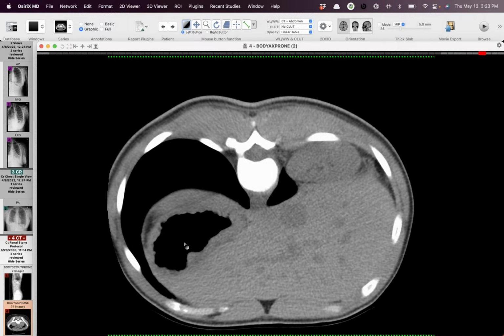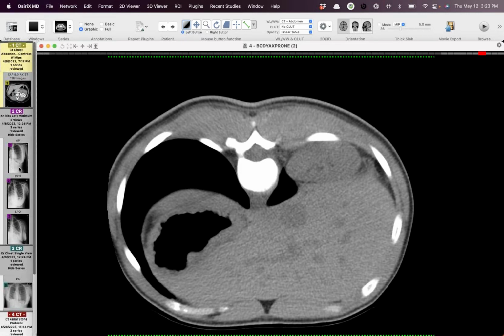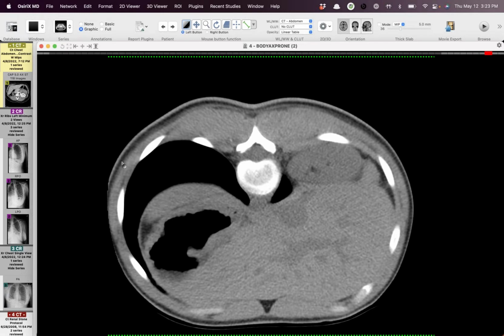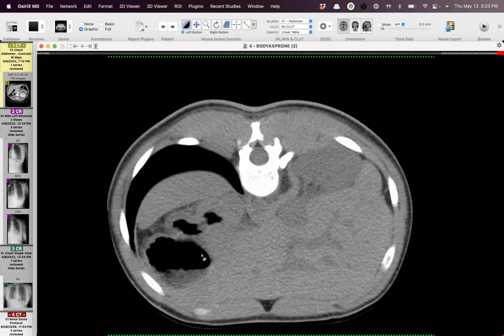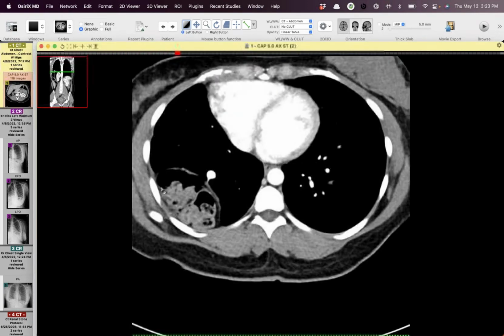So we ended up thinking this was not a traumatic hernia, at least not an acute traumatic hernia. If she wasn't having pain in that location, then that would support your notion. Right, and since the CT got done outside after the radiographs, I don't know exactly what happened in terms of whether they're going to repair this. Hopefully they're going to repair her scimitar. But going back to that, I guess we didn't even really talk about it.